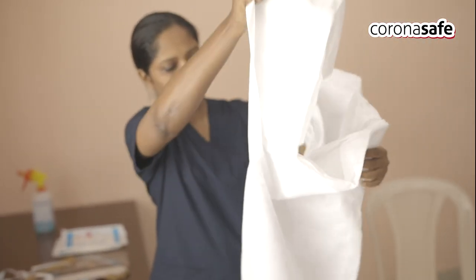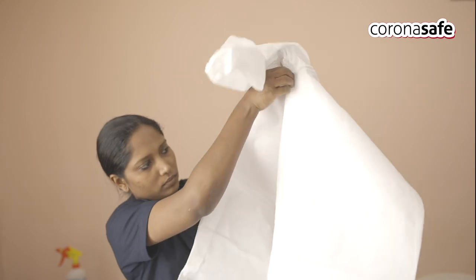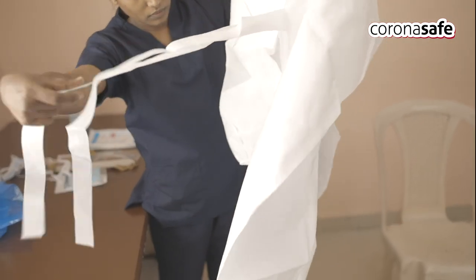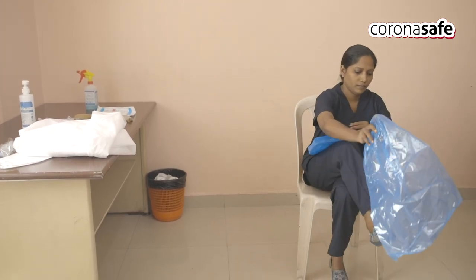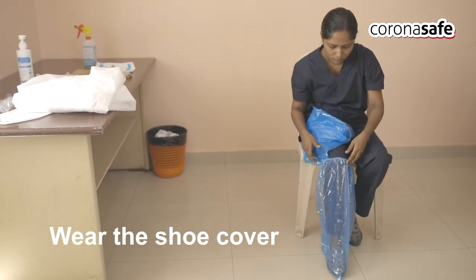Check for damage of the coverall and check that the zip is working. Start donning the PPE one by one. First, wear the shoe cover of both legs one by one.